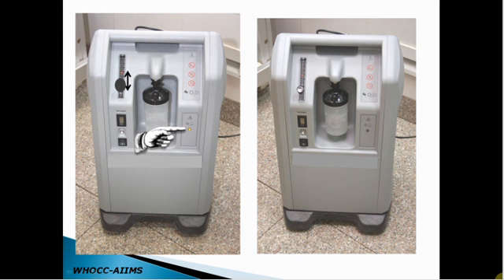This light will be on till the desired concentration of oxygen is achieved, which in most concentrators is nearly 90 to 93%, after which the light goes off. Every manufacturer has its own way of showing the achieved desired concentration. In some concentrators, this yellow light will become green after achieving the desired concentration.